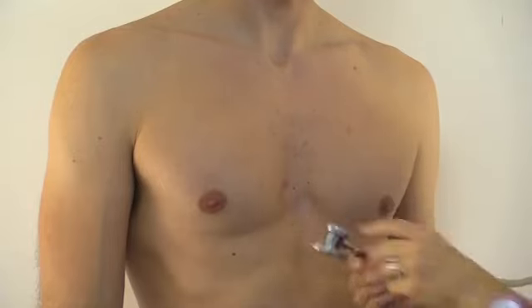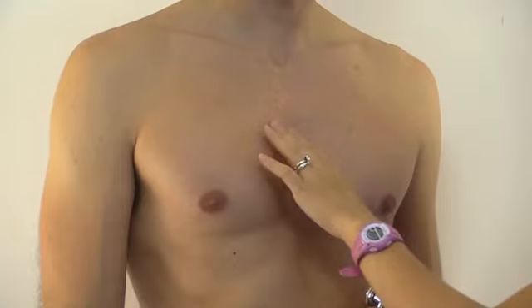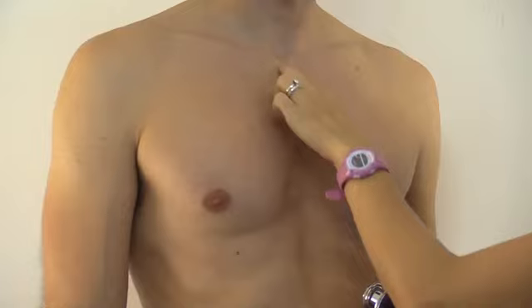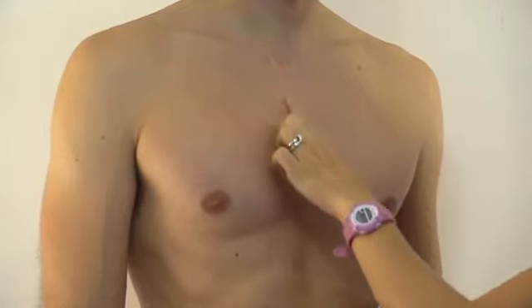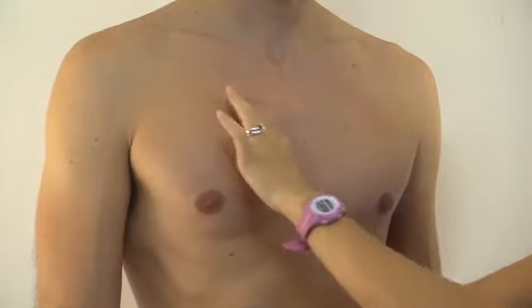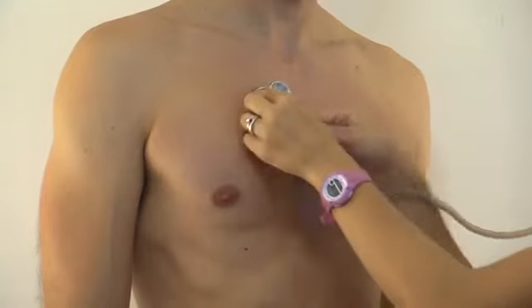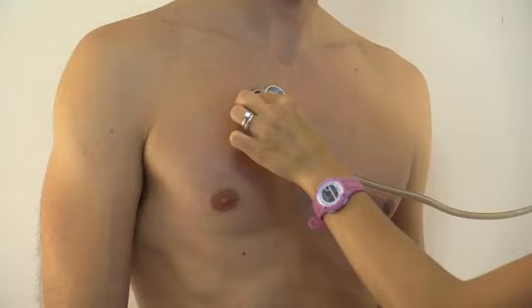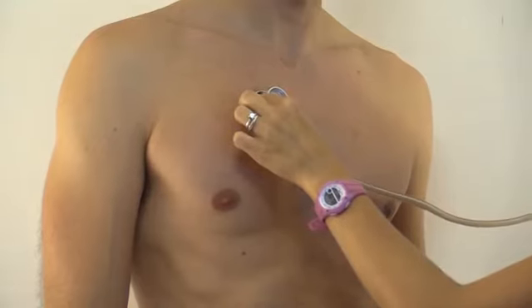Using the diaphragm, we're going to listen at the right sternal border at the second intercostal space, and that's the aortic valve. To find the second intercostal space, find the sternal notch, go down to the angle of Louis, then go a little bit to the right, and you're in the second intercostal space. We're just listening: lub-dub, S1, S2, and S2, the dub, is going to be louder in this location.